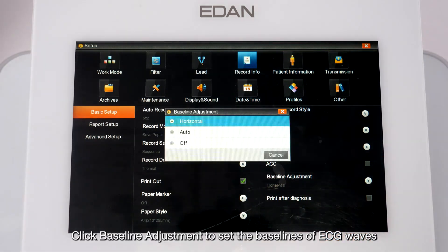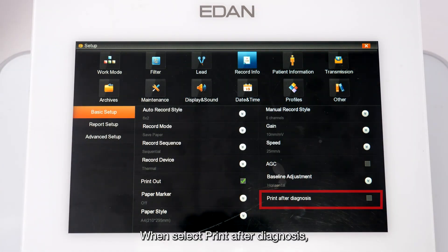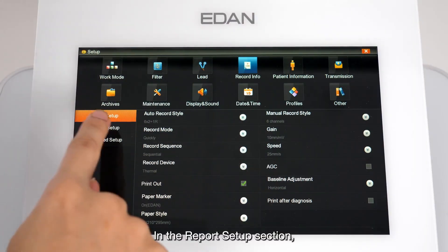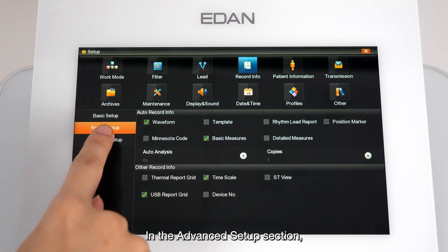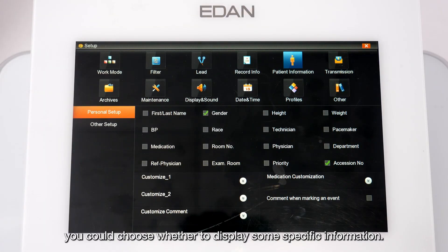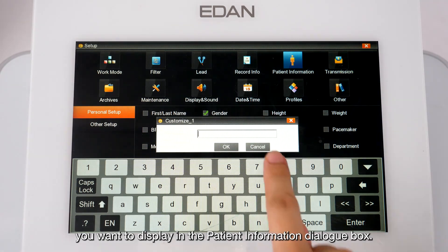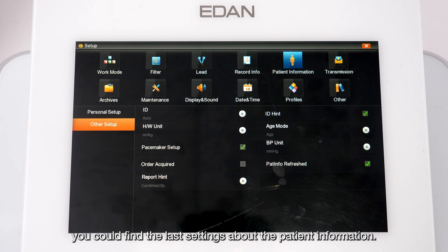When Print After Diagnosis is selected, if a user attempts to print an ECG report that has not been diagnosed by a doctor in the archives, the system will prompt for confirmation before printing. In the Report Setup section, several buttons allow changes to printing settings. In the Advanced Setup section, you will find settings for pharma study record info. In the Patient Information interface, you can choose whether to display specific information.